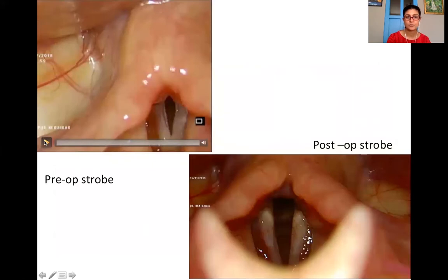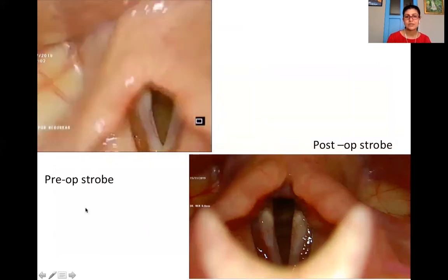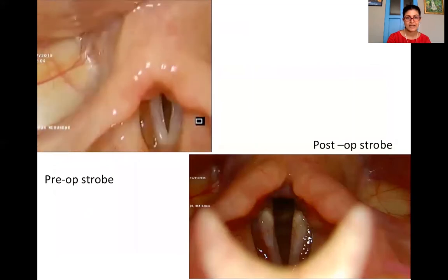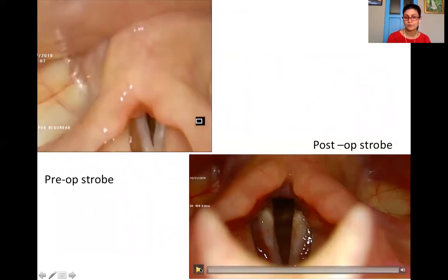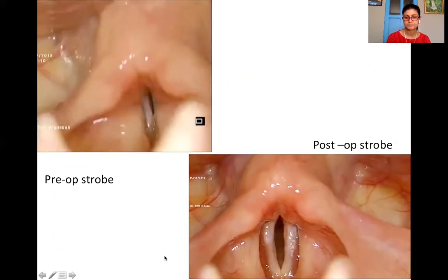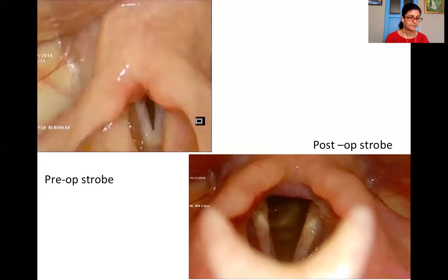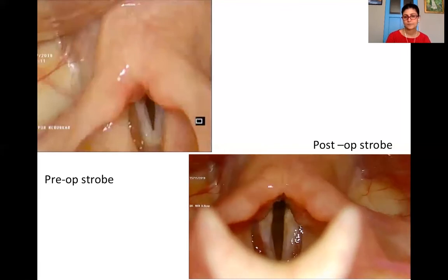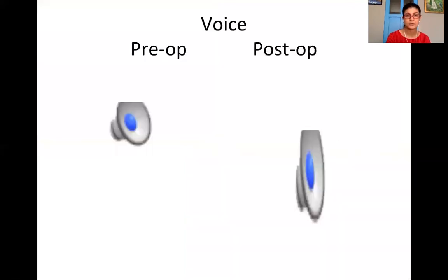This is a pre-op strobe of a patient showing a spindle-shaped phonatory gap and no mucosal wave whatsoever. In the post-op strobe, the phonatory gap is decreased dramatically and the mucosal amplitude is quite good.